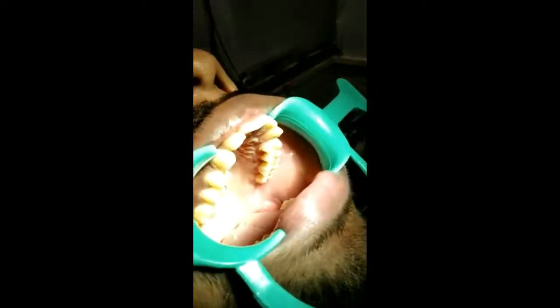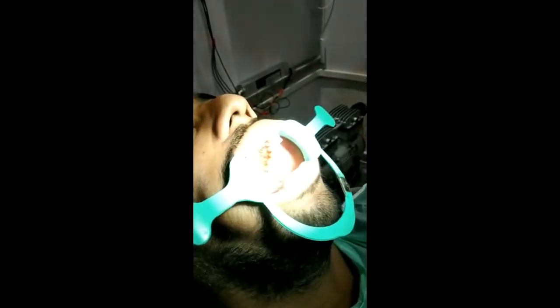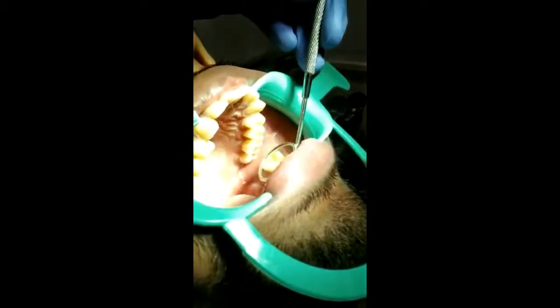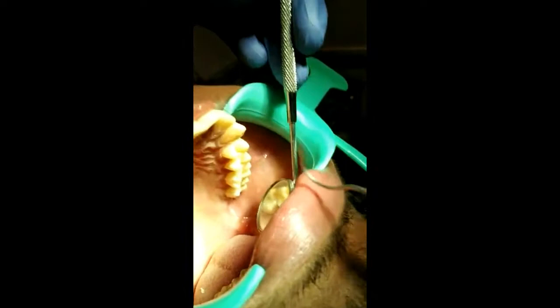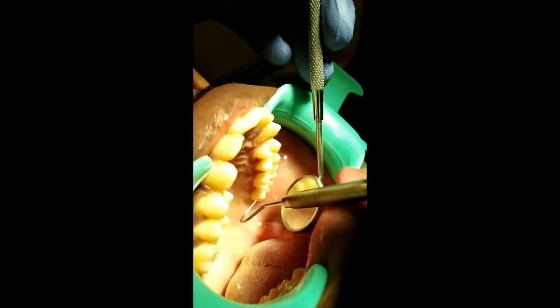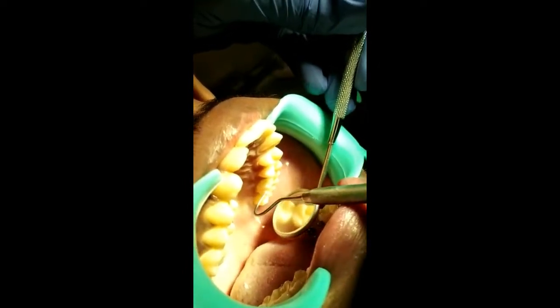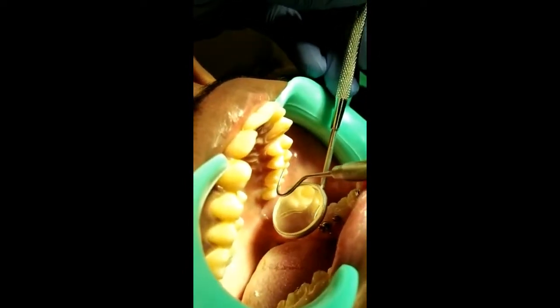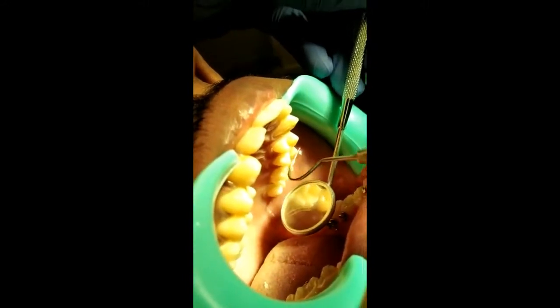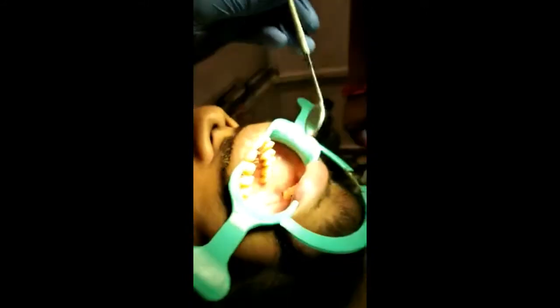As you can see here, we are bonding only the posterior segment of the left side, because we will be planning the extraction of the first premolar. The brackets that are being bonded shall be on the second quadrant: the second premolar, the first molar and the second molar. The patient has already undergone extraction of the third molars before the orthodontic therapy commenced. The teeth are already etched and rinsed and isolation is done.